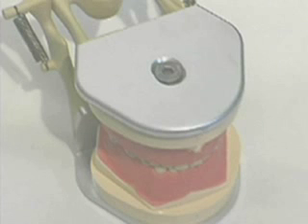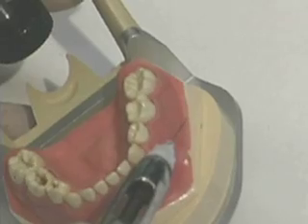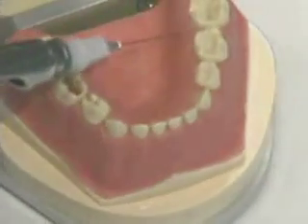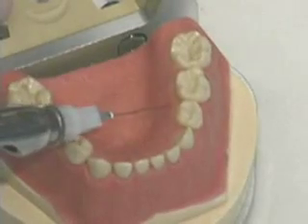Local anesthesia is normally required for this exercise. Some of these teeth will already have been pulp treated or may need pulp therapy, but you will still be required to provide soft tissue anesthesia for the stainless steel crown fabrication. In the event that it's pulp treated, you can administer an infiltration or papillary infiltrations around the marginal gingiva. Whenever a rubber dam is required, anesthesia is also required. A rubber dam clamp should be placed on the tooth distal to the one you work on.